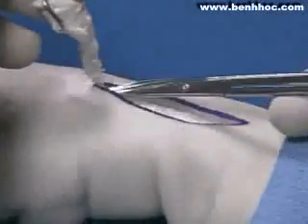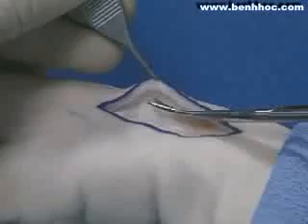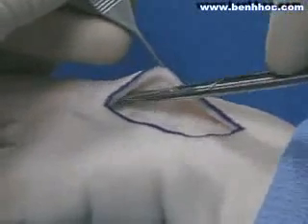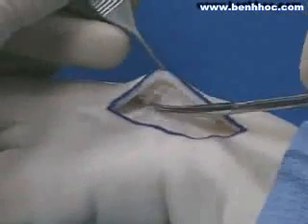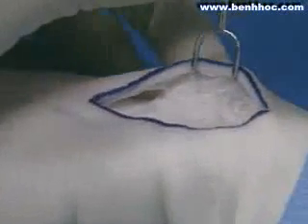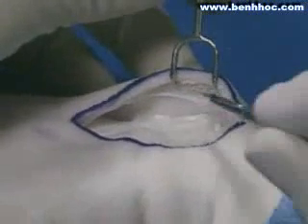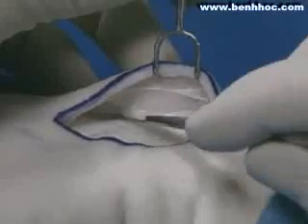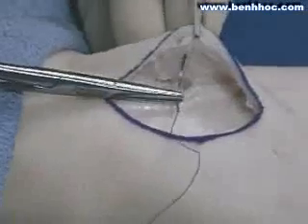In order to allow the tissues to come together during the closure, undermining is necessary. When scissor dissection is used, the tips of the scissors are best kept tip upwards towards the skin edge so that the deep structures are not inadvertently cut. A number 15 blade can also be used to continue the undermining. This demonstrates that either a scissor or a number 15 blade can be used to undermine the soft tissues, which will allow closure without tension.